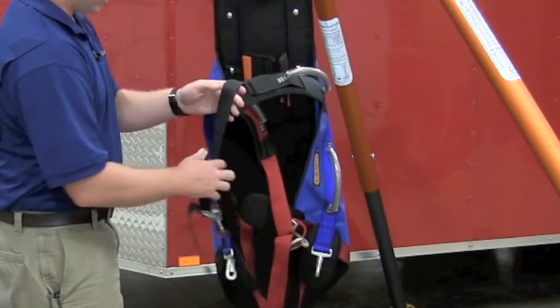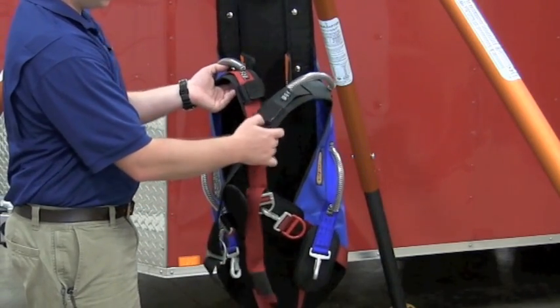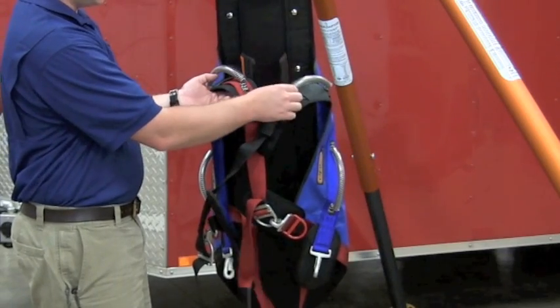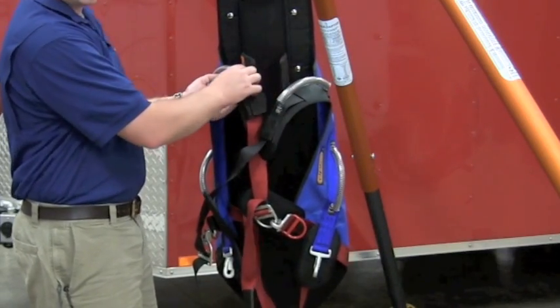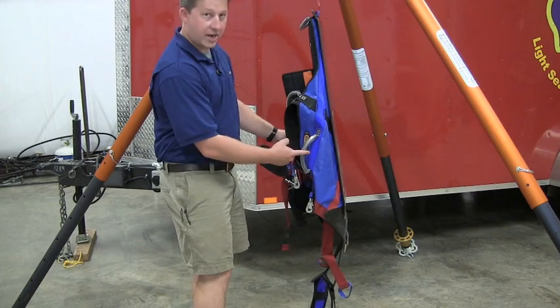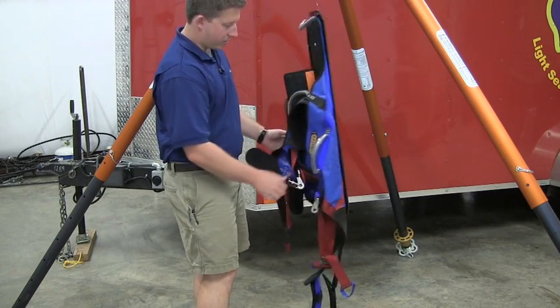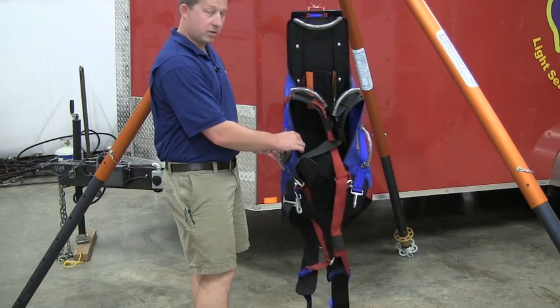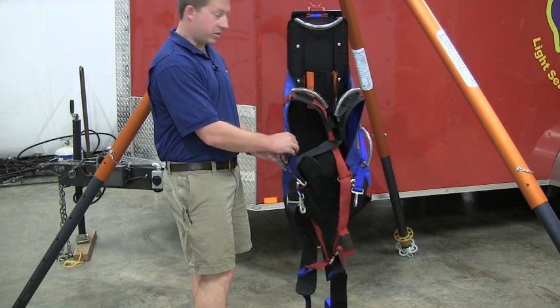On the top of these straps, you see there's two good size handles to be able to drag the patient with. Again, these are not for lifting. They're not attachment points. These are just drag handles. You'll notice on each side of the device, they have drag handles there on each side so that you can move patients, especially in confined space situations. This is really convenient to have.